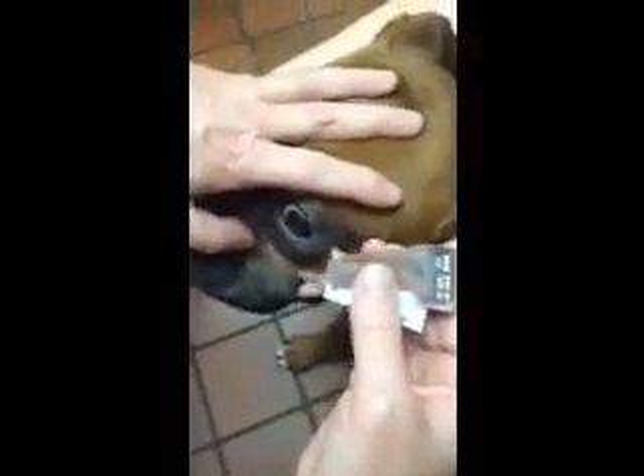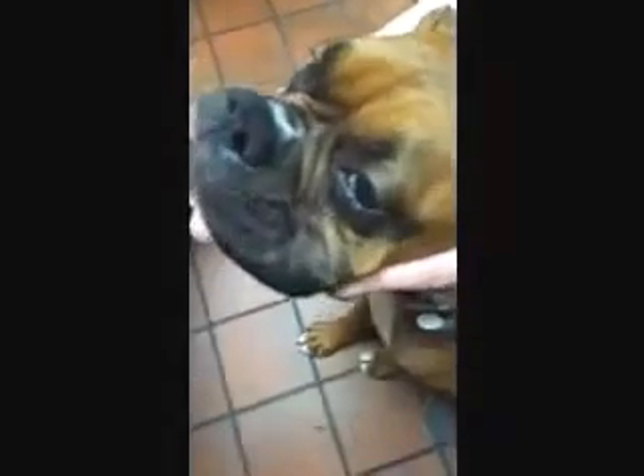Third, I'll have the handle of the blade angled slightly away from Bailey, so again if she moves she will not run into it. Between all three of those safety measures we can perform a conjunctival scraping safely and Bailey's going to be fine. Now we'll go ahead and prepare the slide according to Dr. Croydell's instructions.